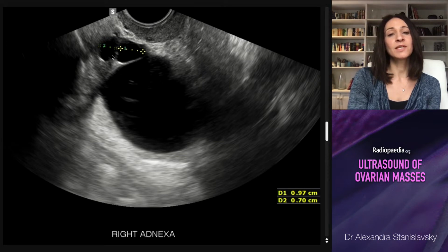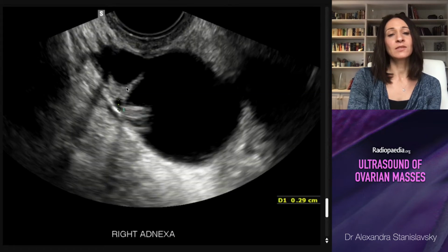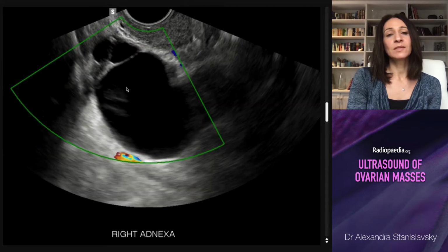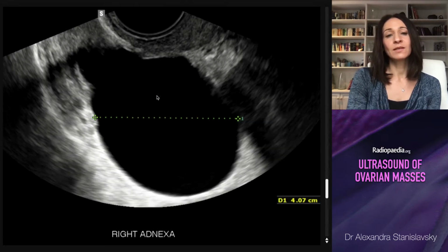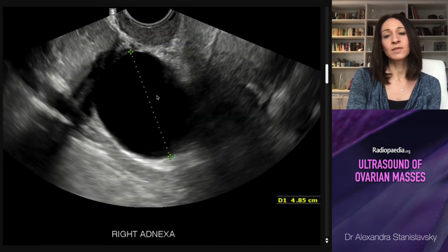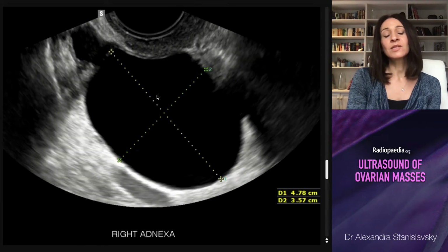There are some septations, and we don't see any solid components. So this is a multilocular cystic mass in the adnexa. It's got a couple of smaller locules and one larger one, measuring just under 5 centimeters. And there's nothing else to it.